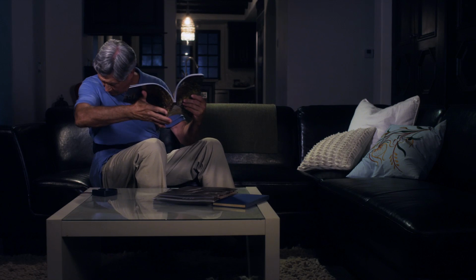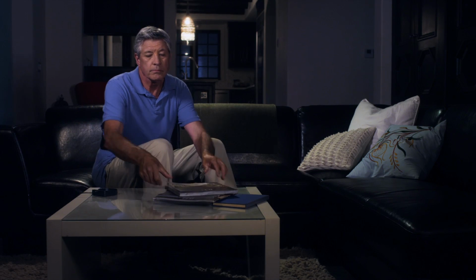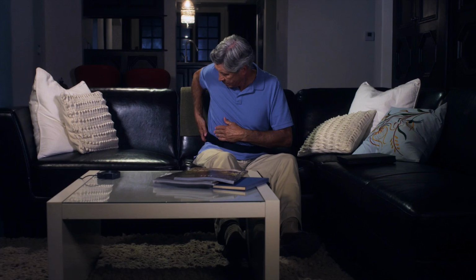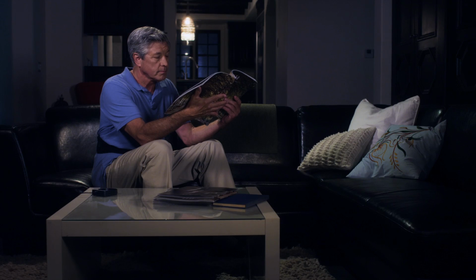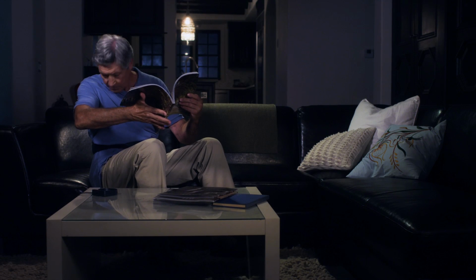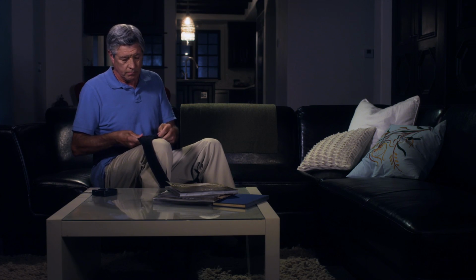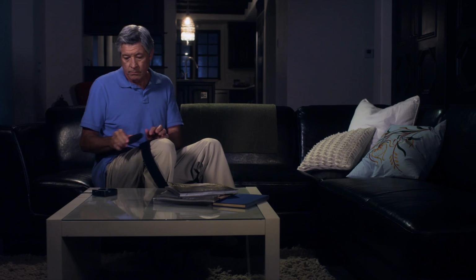Beep meanings. Different beeps have different meanings. The end of a charge signal is a distinct double beep. The misalignment signal is a steady, continuous beep telling you the charger is out of position. If the charger needs to be recharged, it beeps slowly, no matter what kind of alignment it has with the stimulator. When this happens, discontinue charging the stimulator and put the charger back on the base station to recharge.